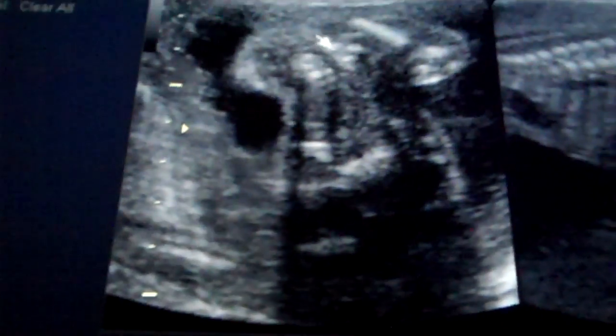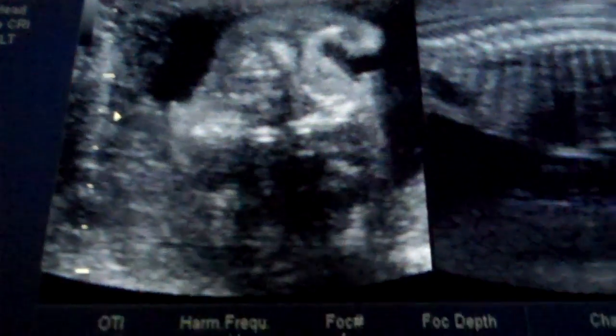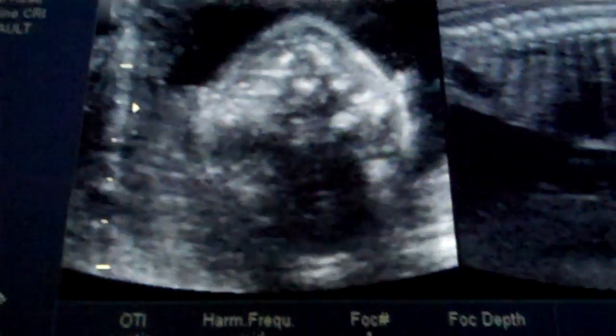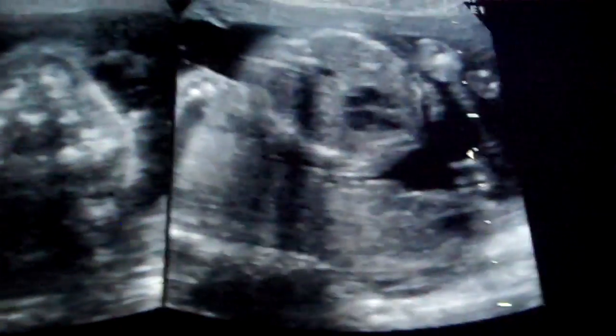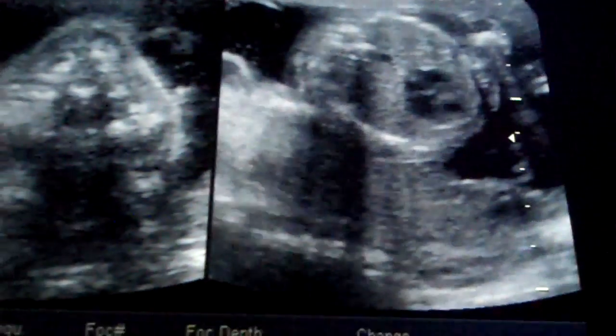And that's the long axis of the spine. Here I've just turned 90 degrees — you're still looking at the spine but on end, so short axis. What you're going to be watching is this white circle right here, starting with the neck and following it all the way down. This is the upper back, you see the chest, the heart out front. Is that the heart? It's the heart. We're going to look at that in more detail shortly.